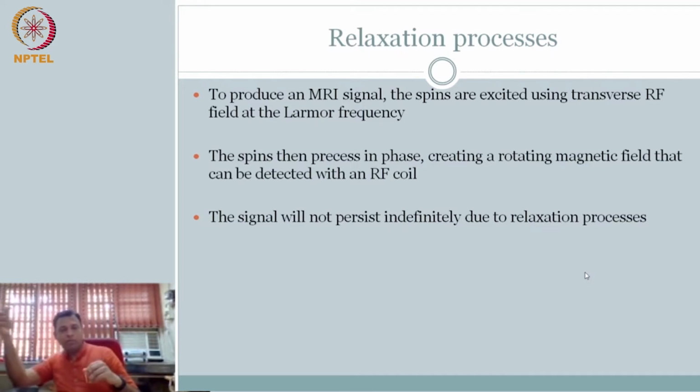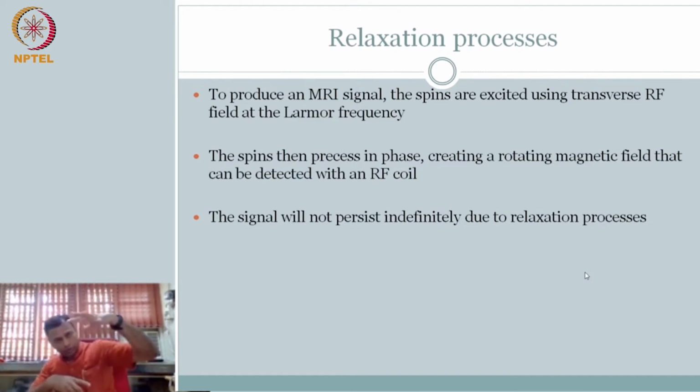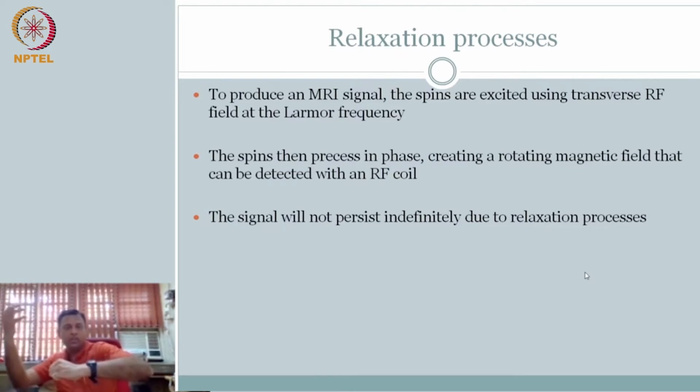Initially, you're adding B1, forcing them to come together and pushing them to flow. Here, in some sense, you're forced. So that is forced precession. Now you have removed the excitation, you have removed the force, so it has to relax. It will relax, and everything will dephase in the XY plane. All the vectors will be in different directions, and eventually they will try to align themselves to having only a Z component in the static field, right? That is what the relaxation process will be.